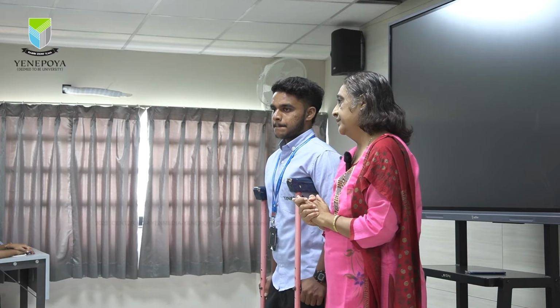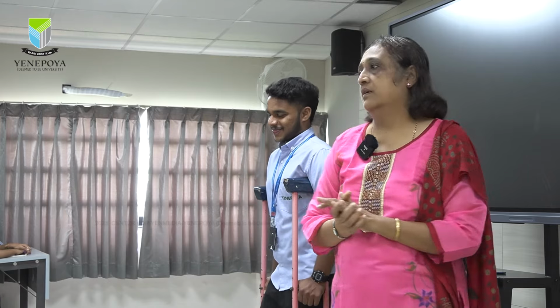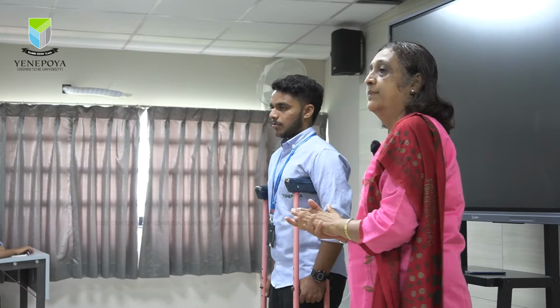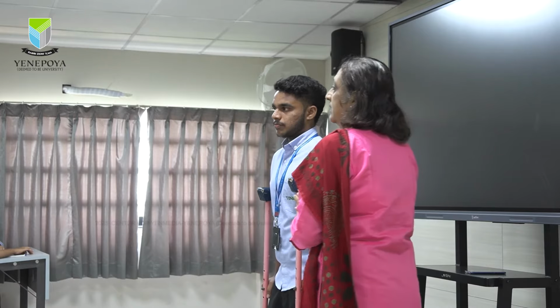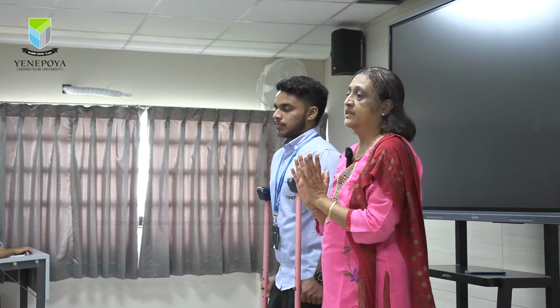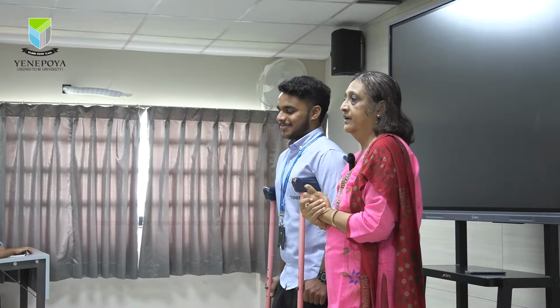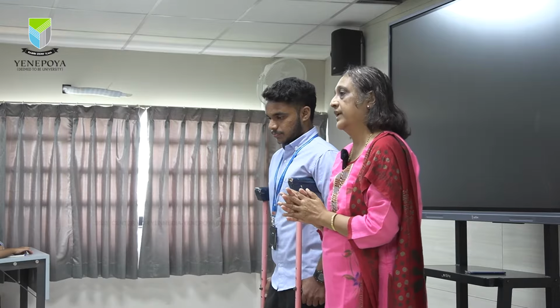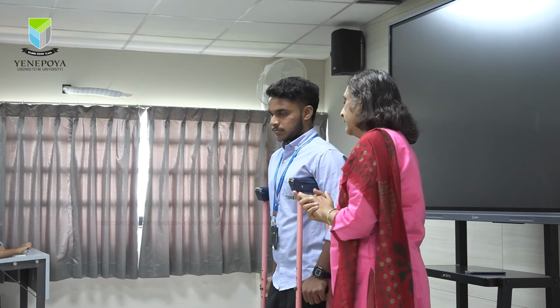a 3-point gait. Okay. Now, in the 3-point gait also, for the person to be comfortable first, the person walks with the swing 2 gait. We train the patient with the swing 2 gait. When he is comfortable, he can go to the swing through gait. Now, what is a swing 2 gait and a swing through gait, that I will demonstrate.